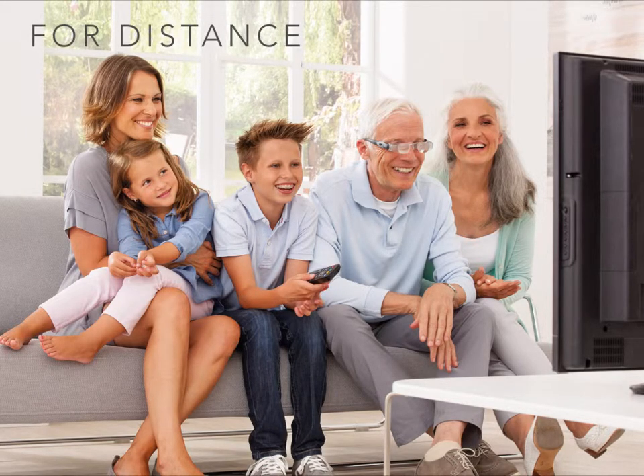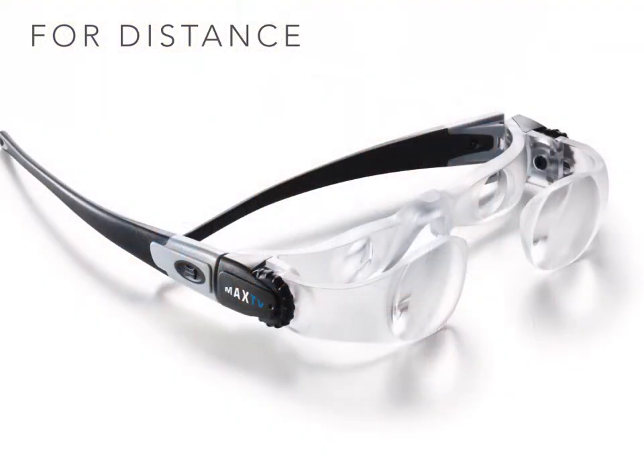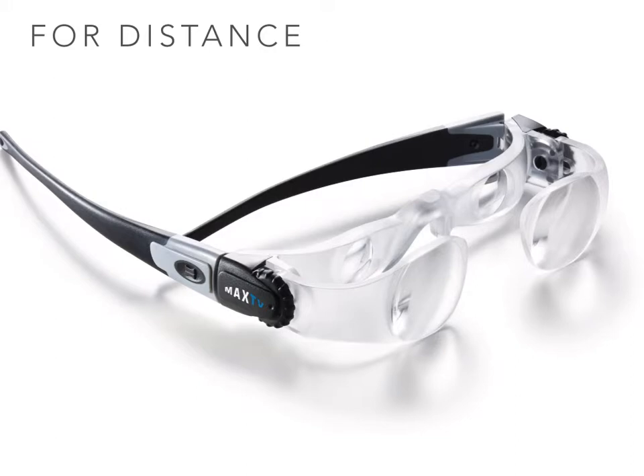Using the same basic telescopic principles, a similar device has been designed for distance viewing. This magnifier allows the user to sit at a more sociable distance from the screen, benefiting both the user and their family. The two times magnification is achieved at an optimal working distance of approximately 3 metres. However, fine adjustments may be made using the cog if the patient sits significantly closer or further away from the screen.